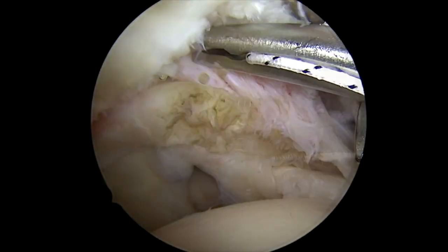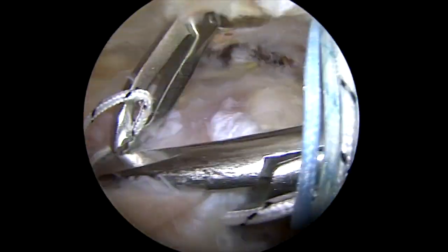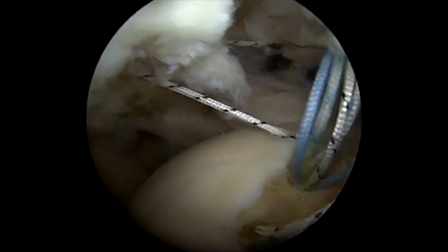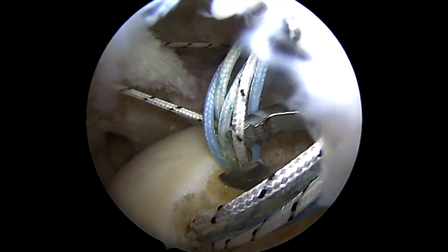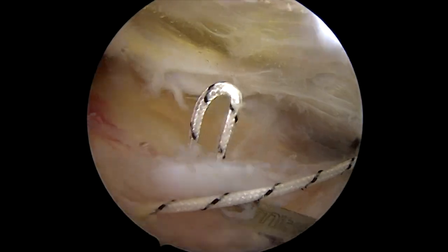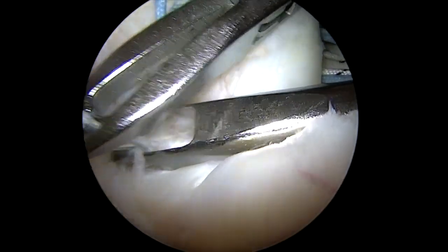So I use this suture passer — I think you can pass however you'd like, but this one is particularly efficient for me. We find that burn mark, and then I'll bring the sutures out through the anterolateral portal as I go. This is a particularly efficient way of doing it because as you go, the sutures get passed kind of out of your way, making sure there's not going to be any opportunity for the sutures to get tangled up. There's only one suture coming through the cannula at any one time, and I really only use one cannula.